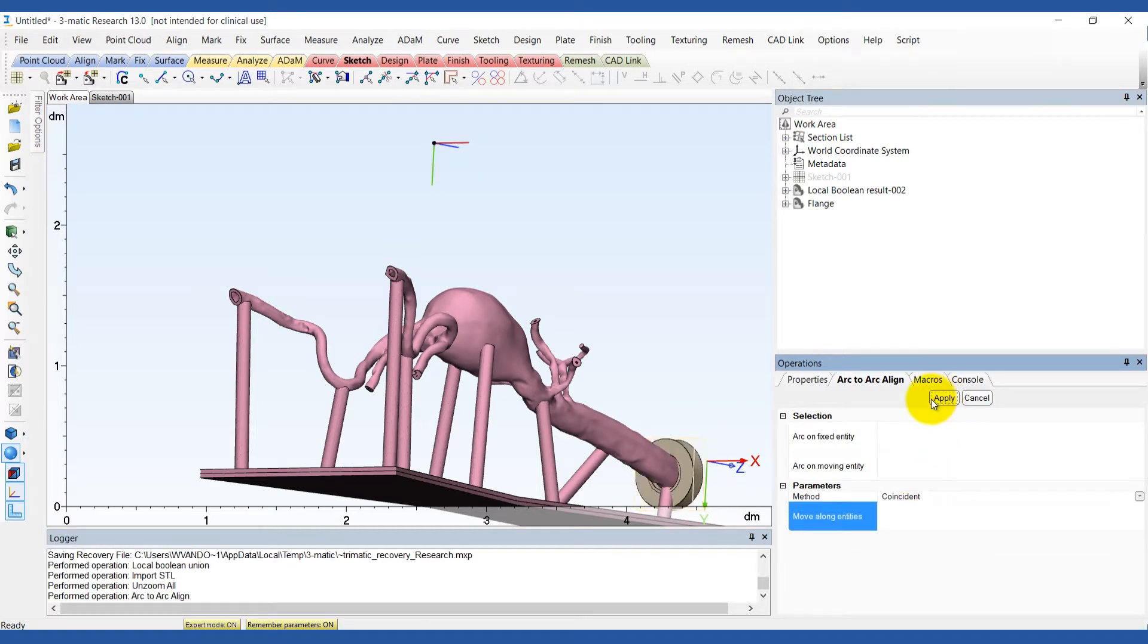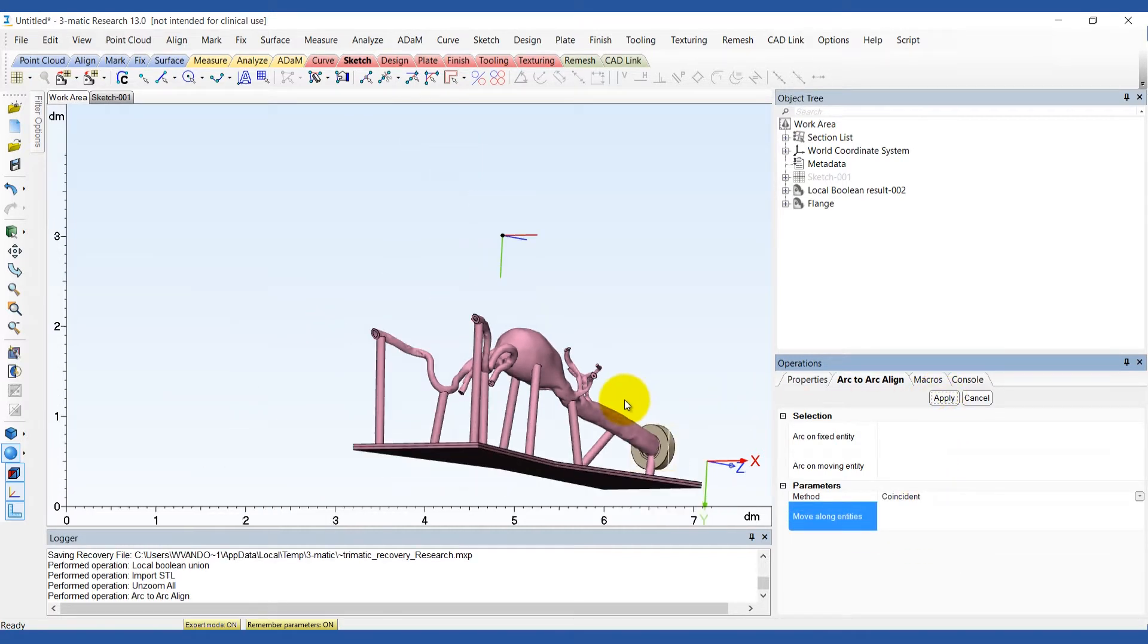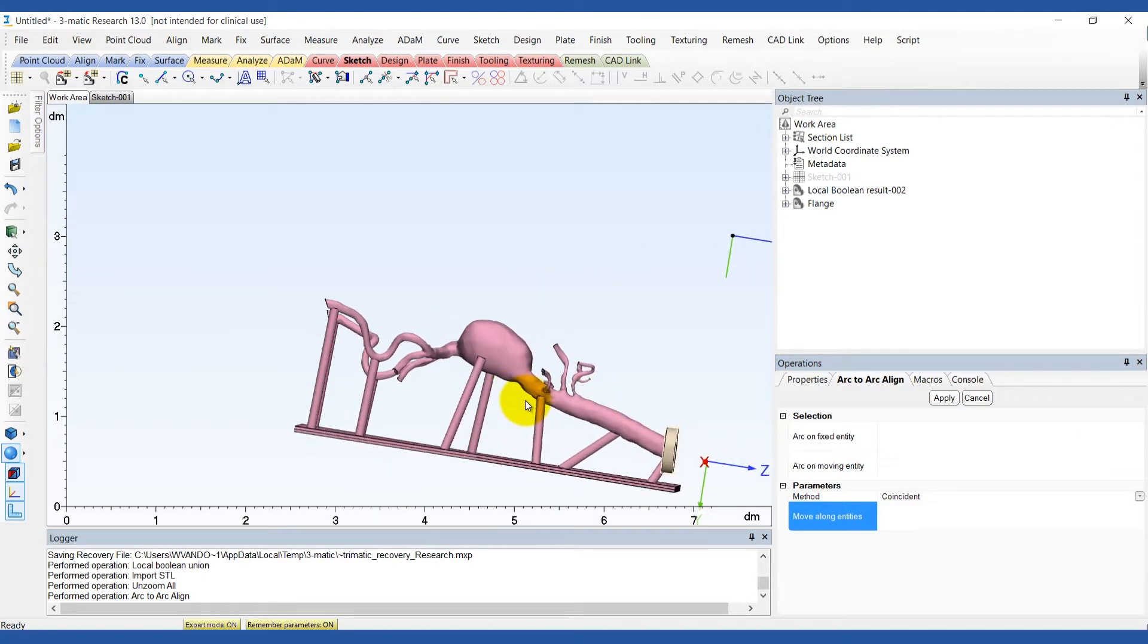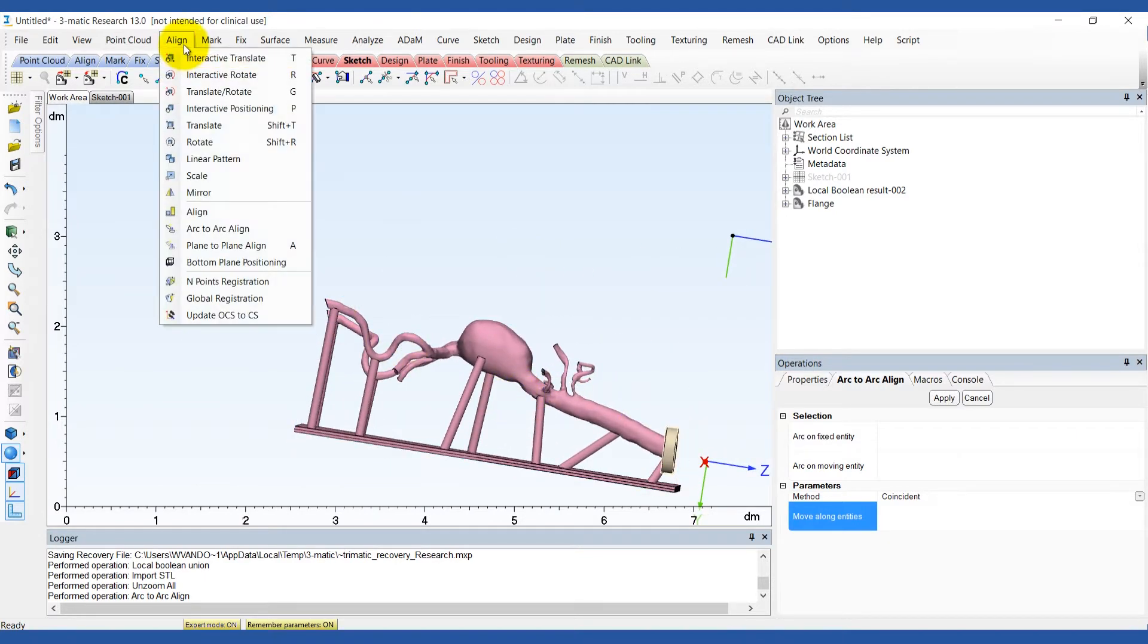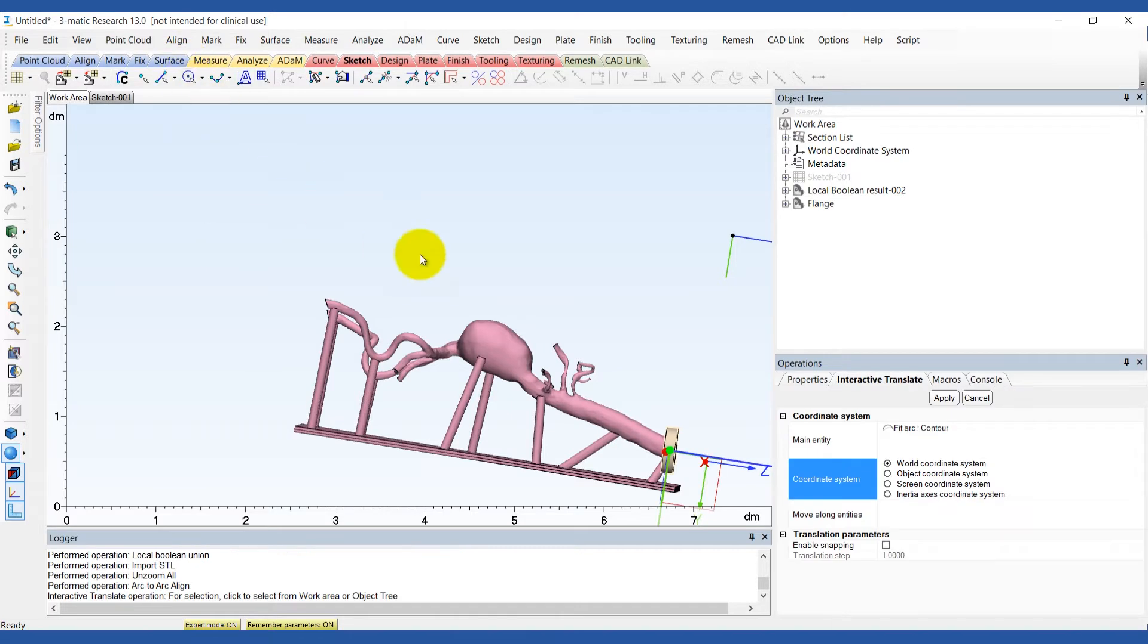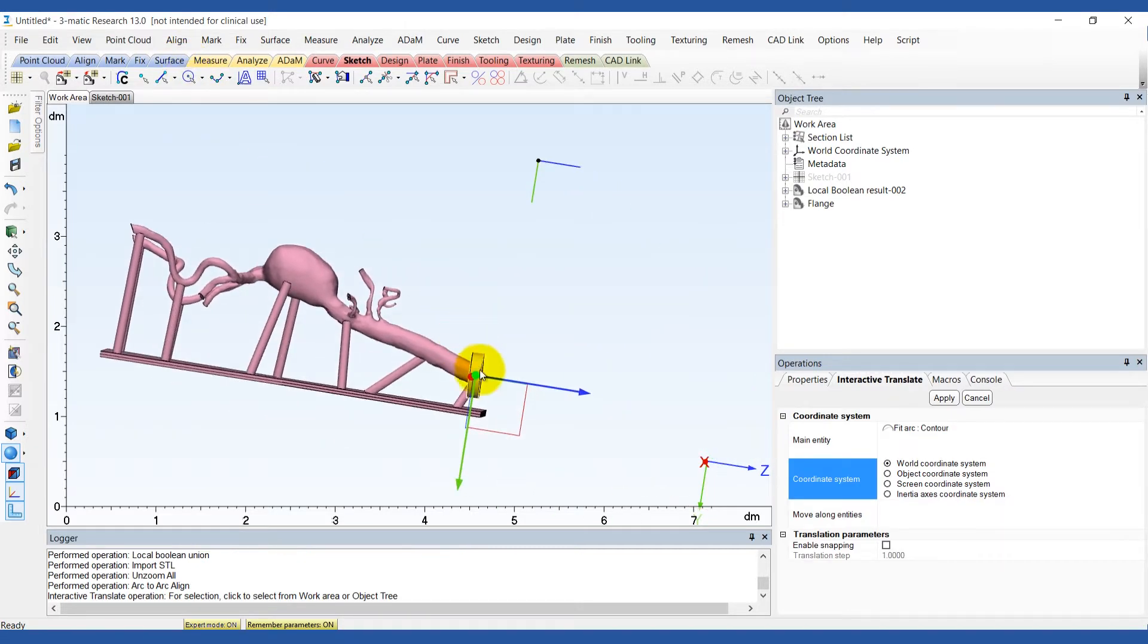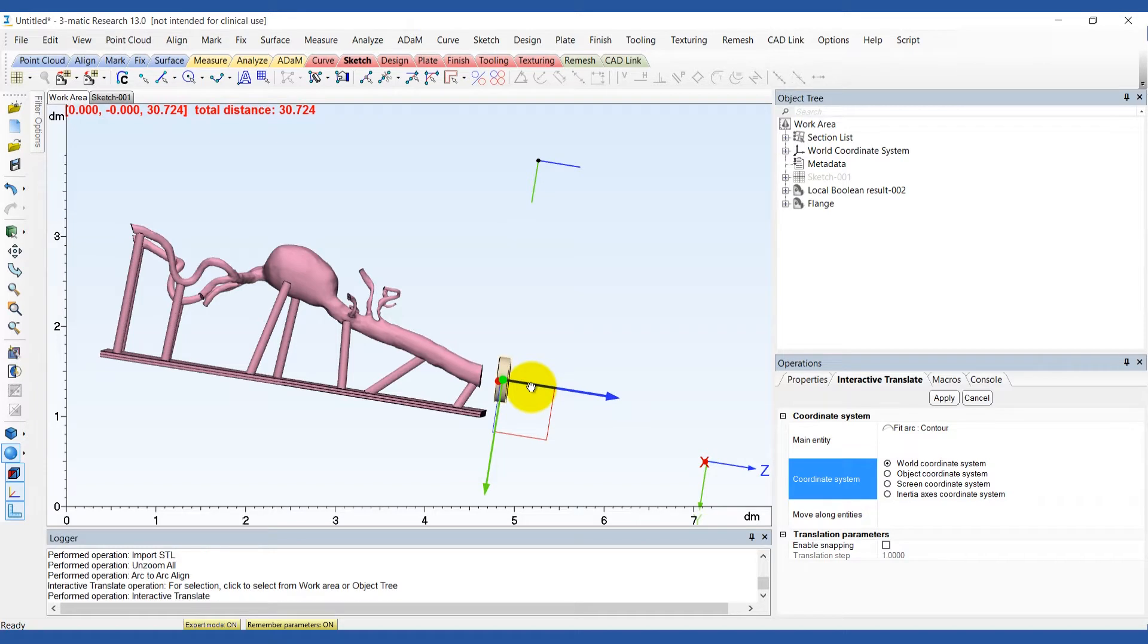Now that the flange is correctly aligned with the model, we need a nice transition between the two. To close the gap between the two parts, use the interactive translate tool in the align menu. This will translate the flange in the z-direction by approximately 30mm.